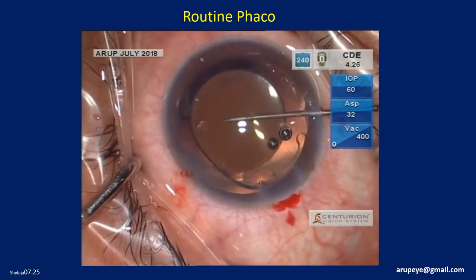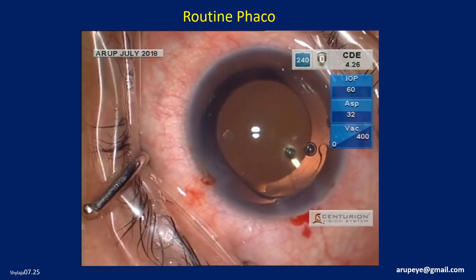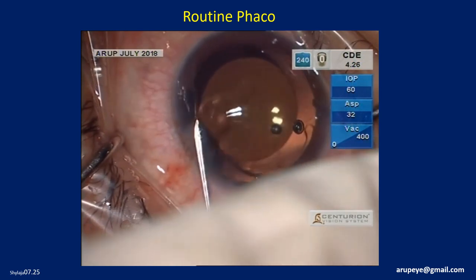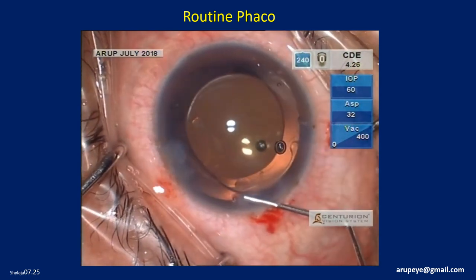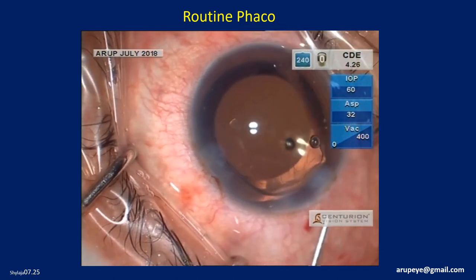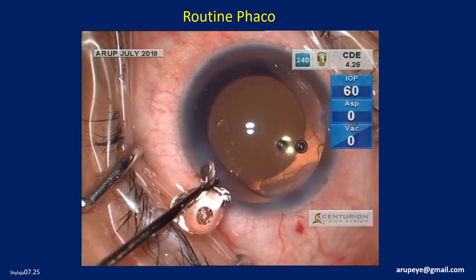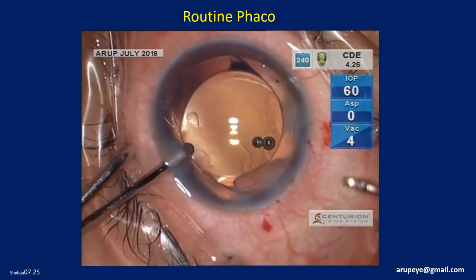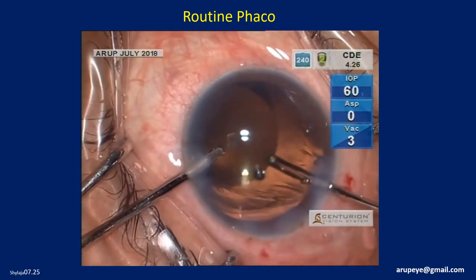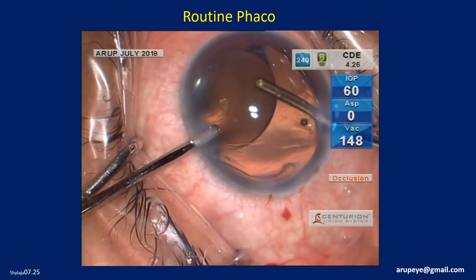The corneal incisions will be hydrated — stromal hydration as well as the main clear corneal incision — before the residual OVD is removed from the anterior chamber and the capsular bag. The OVD removal should be as complete as possible, and one might have to go behind the optic to access trapped OVD.